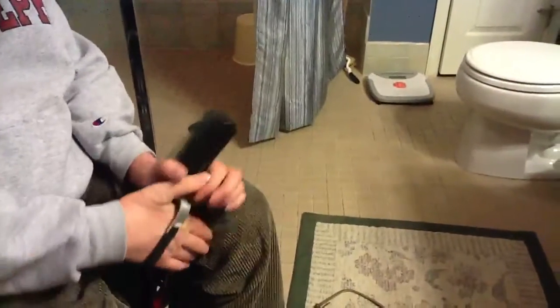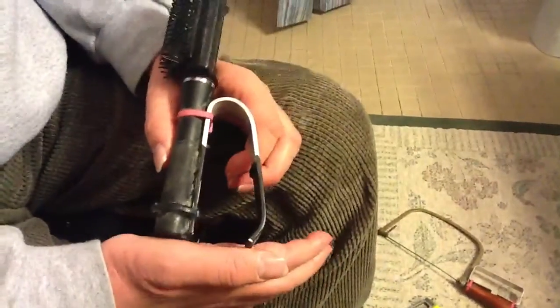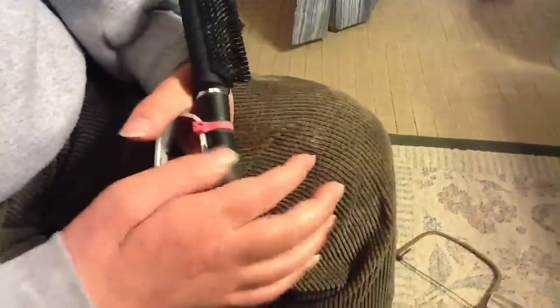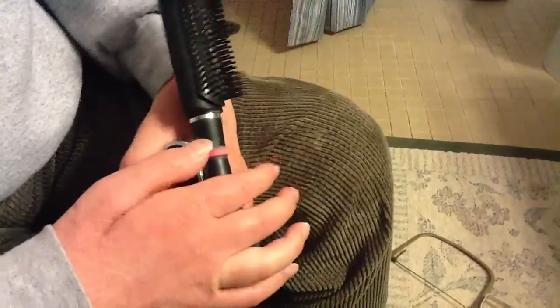Once you get something that really fits your hand well — you can see this fits my hand pretty well — you want to tie wrap it to the device. This is my hairbrush, and there are a lot of different ways you can do it. What I did was just tie wrap it around, pull the tie wrap through, and cut it off as close as you can.